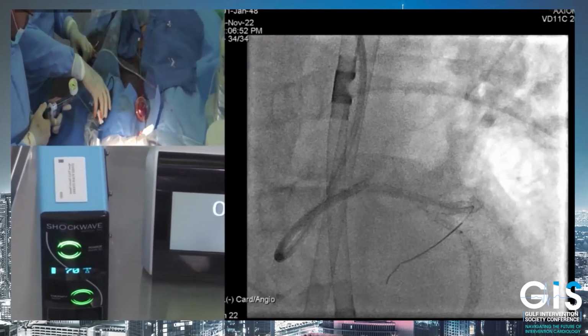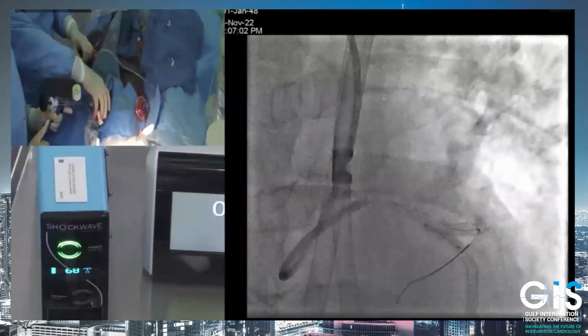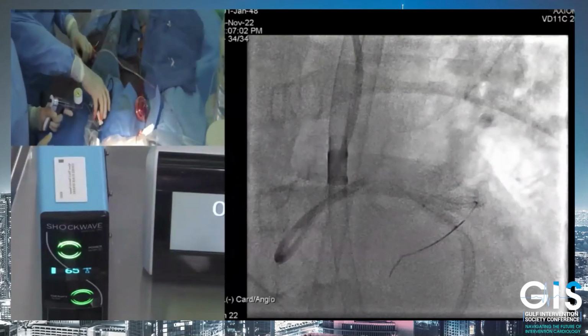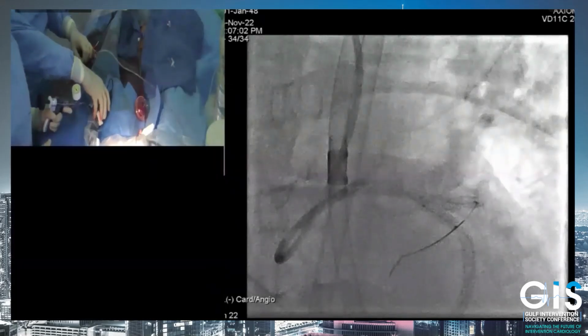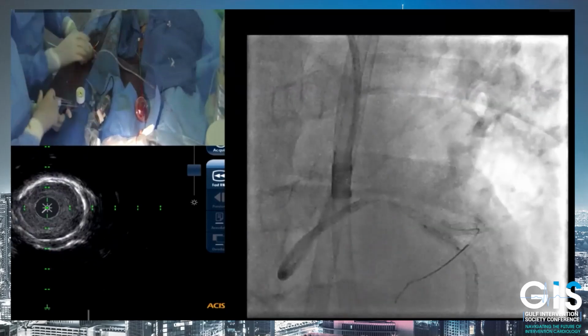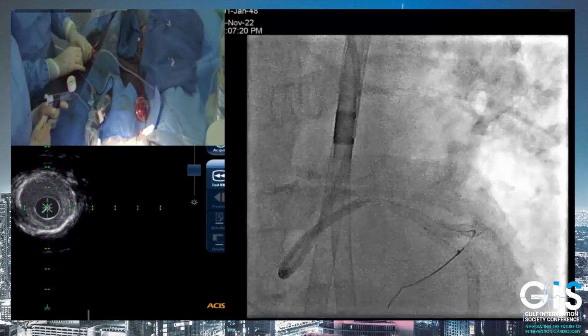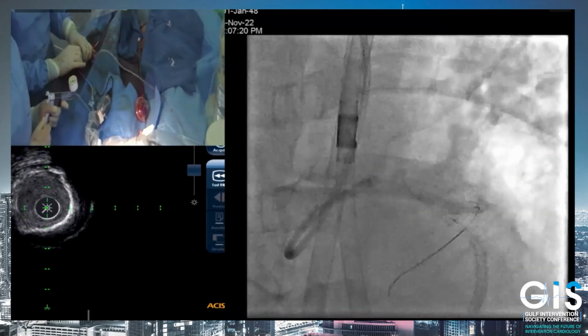There is also the issue of the in-stent restenosis, right? Can you repeat the IVUS run, please? What's this balloon? This is the IVL 3.12, and we did one run at the edge of the stent. You know, we can go up to 8 cycles. This is the ostium, the second cycle. I'll do it throughout this vessel and then more at the ostium.